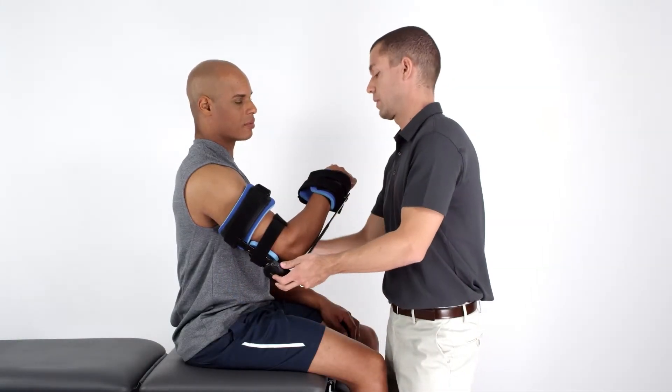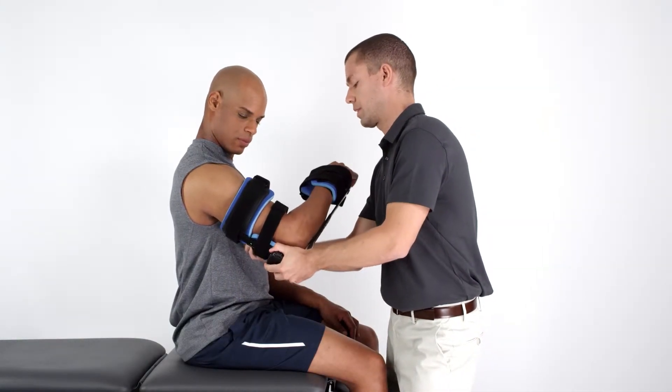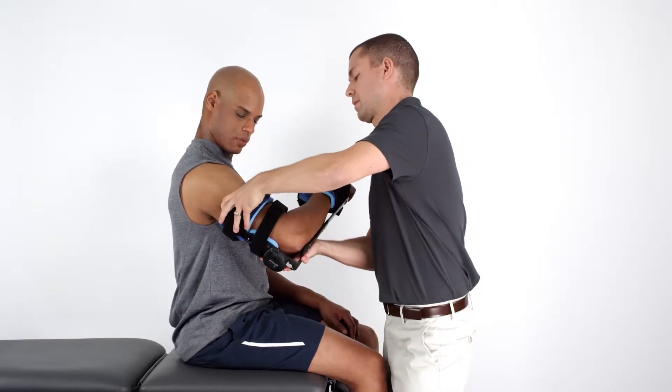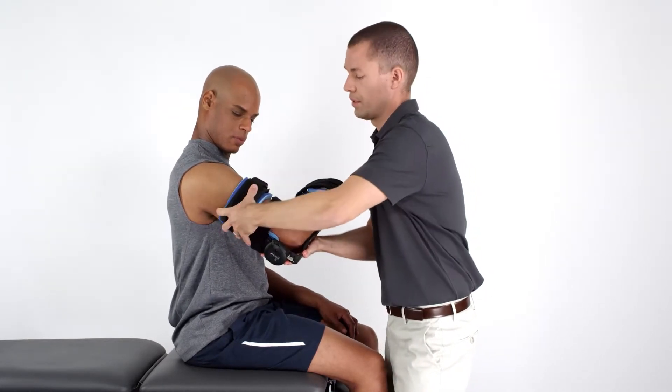After you've adjusted the struts, shape and mold the bendable contour cuffs to the patient's limb to assure a snug yet comfortable custom fit.